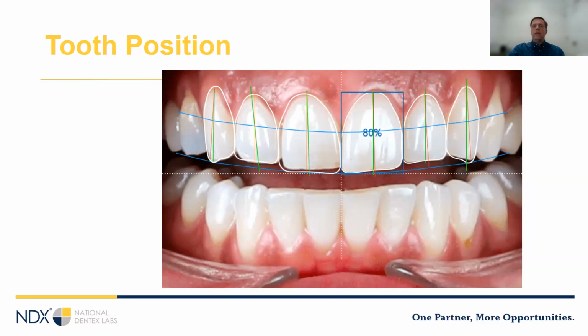One advantage of the all-on-X cases, as you guys know, is that we can pretty much put the teeth wherever we want to. And, you know, there's always a compromise. We'll sometimes wind up with a little bit of a ledge, but that is one of the constraints with the tooth-borne cases, that with tooth-borne cases, our contour has to emerge from the margin. So we want to make sure that when we plan or set a case up for one of these, we're planning so that we can get a good facial shape.